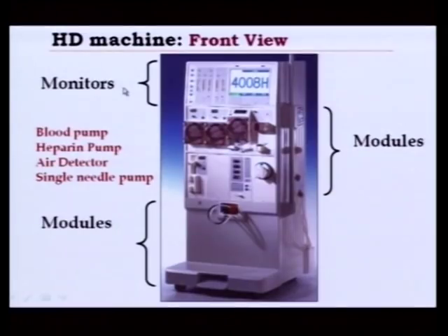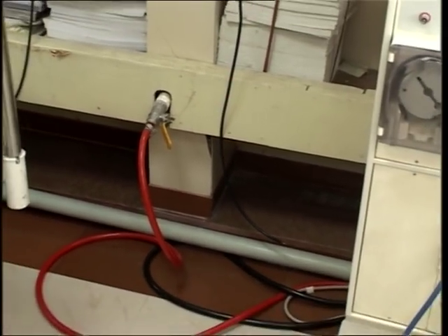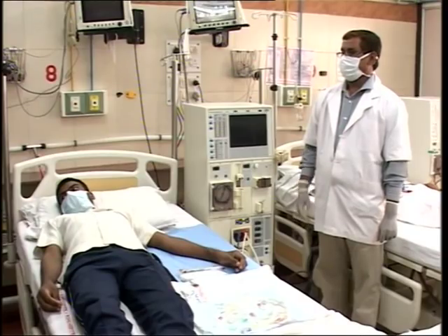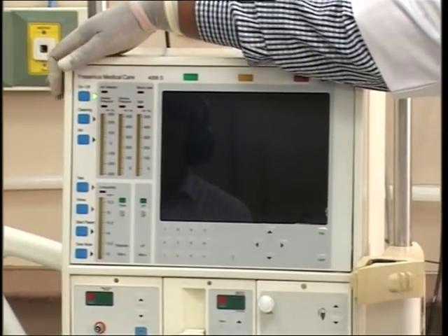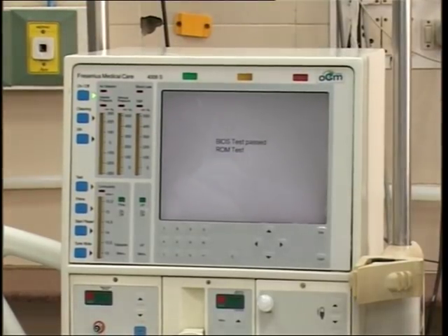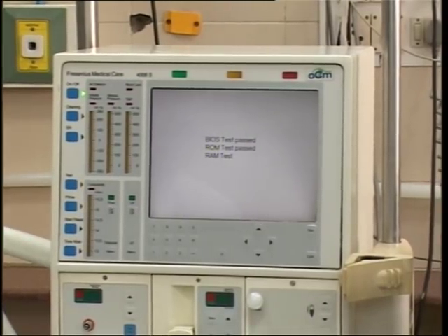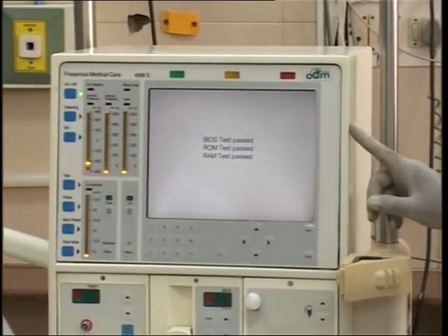Before switching on the machine, ensure that the machine is connected to the water inlet line. Switch on the machine by pressing the on/off switch, usually located on the upper left corner of the machine. The front panel of the machine usually has a screen controlling the various functions of the machine.